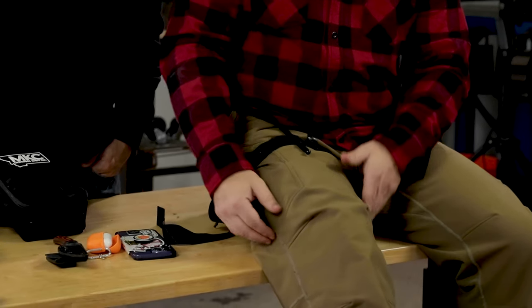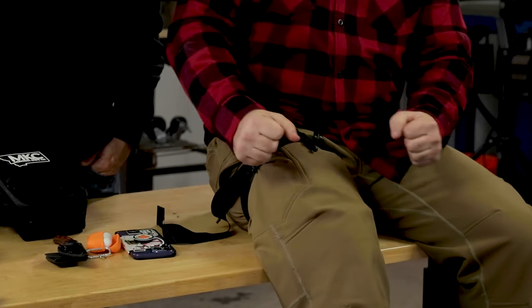I did not try to slip this over my leg the way I put it over my arm — partly because I'm not that flexible, but also this is more realistic. If you're truly injured, you might have a fracture associated with this as well. So it's important to practice taking this apart, using that arch behind the knee and doing that seesaw method rather than just putting it over the end of the foot and working your way up the leg like a lasso. How far above the wound should that be? A minimum of two fingers.